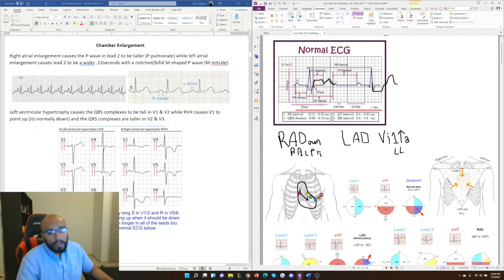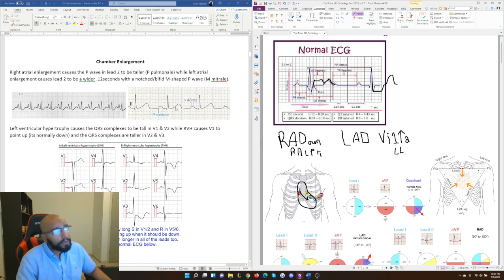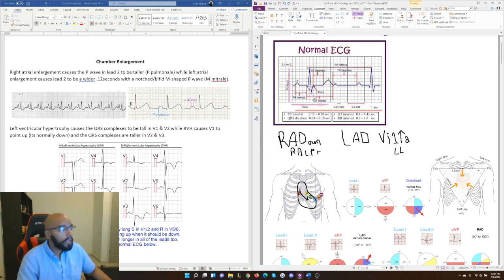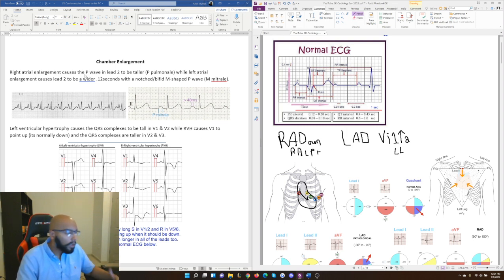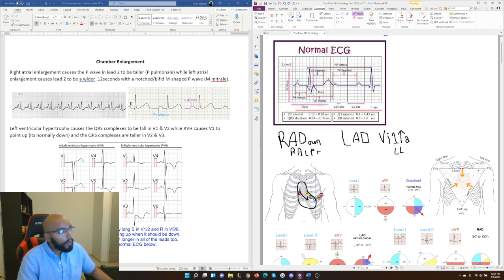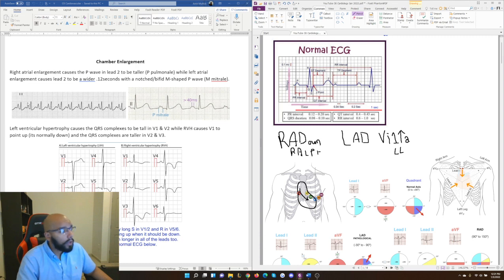Next in First Aid CK is chamber enlargement. It's not tested super frequently but you should know it. You can have right atrial enlargement or left atrial enlargement, as well as ventricular hypertrophy. Right atrial enlargement causes the P wave in lead 2 to be taller than normal — that's it. You can see on this ECG strip that the P wave is almost as tall as the QRS complex, which it shouldn't be.